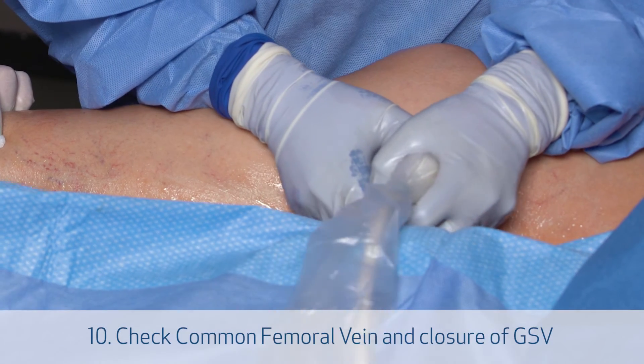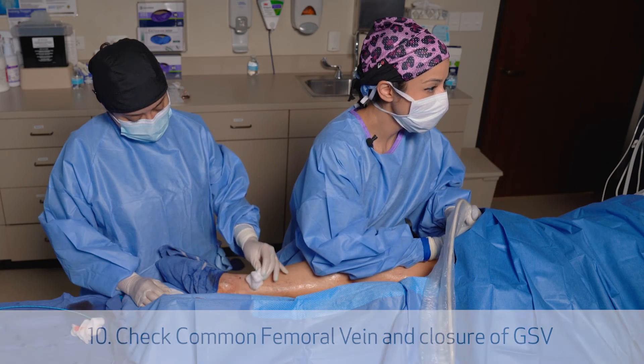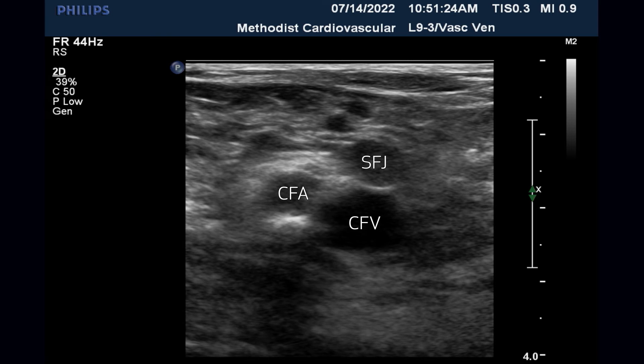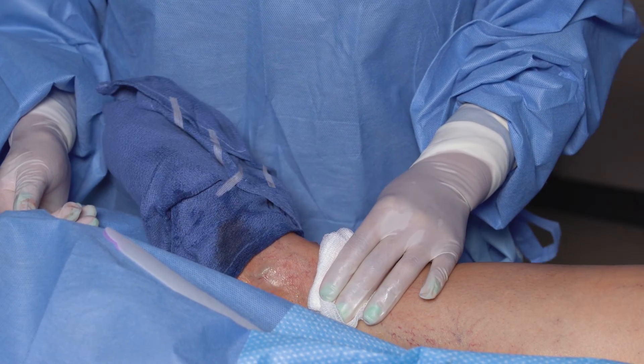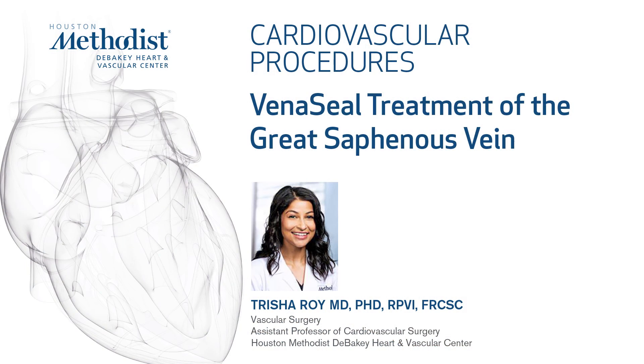Finally, we check our great saphenous vein closure and the femoral vein, making sure it's compressible and there is no DVT. We hold manual pressure at the end. Sometimes it helps if the patient flexes and extends the ankle to remove any residual blood. This was a demonstration of the VenaSeal technique — thank you very much for watching.